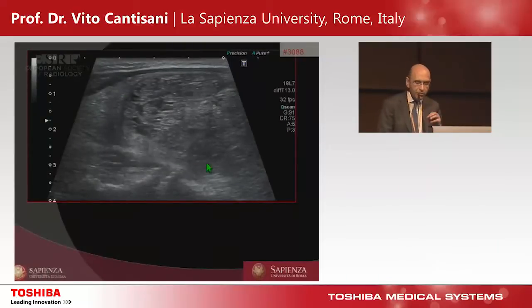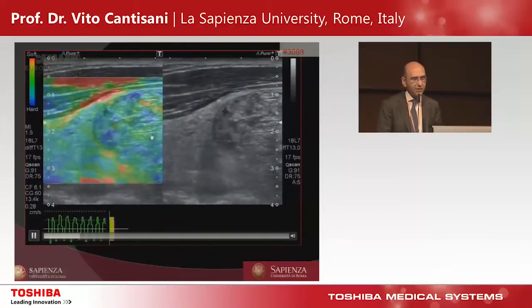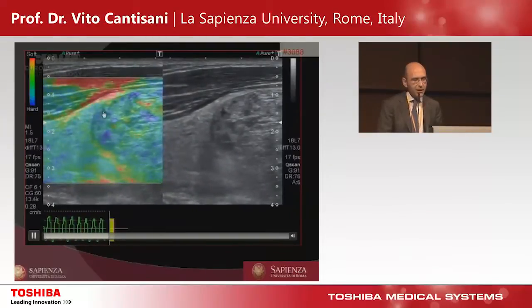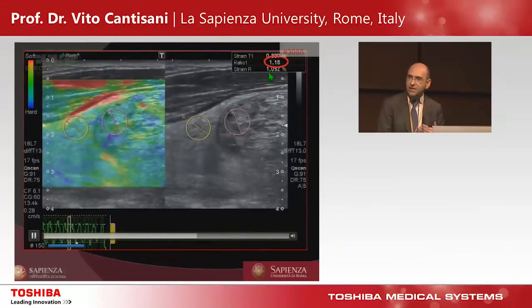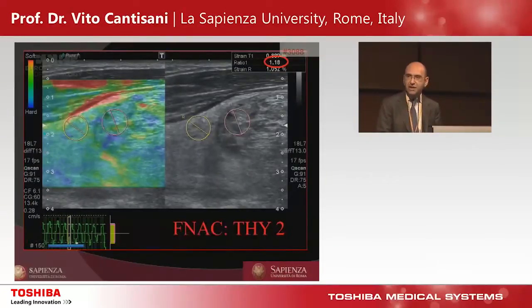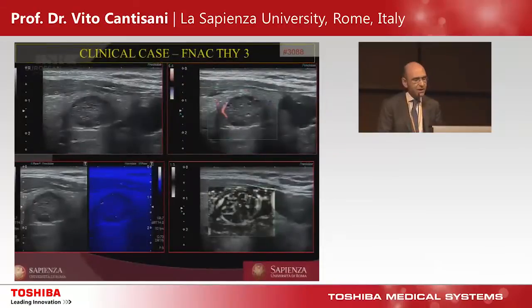Let's see a couple of examples. This is a large iso-hypoechoic, well-marginated lesion. We performed ultrasound strain elastography and obtained a strain ratio lesser than 2, consistent with the benignity of this lesion. We followed this patient and continue to do so.